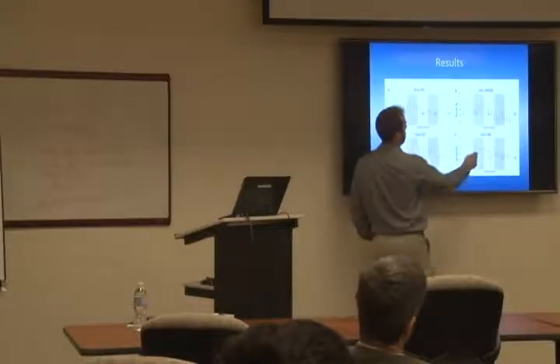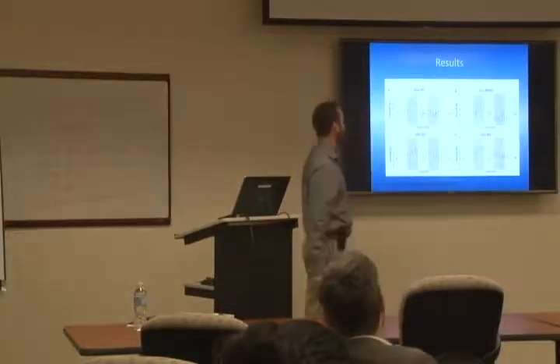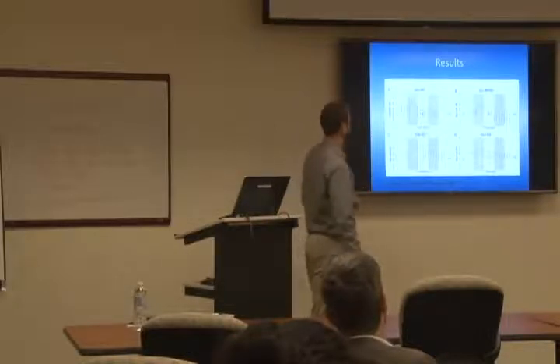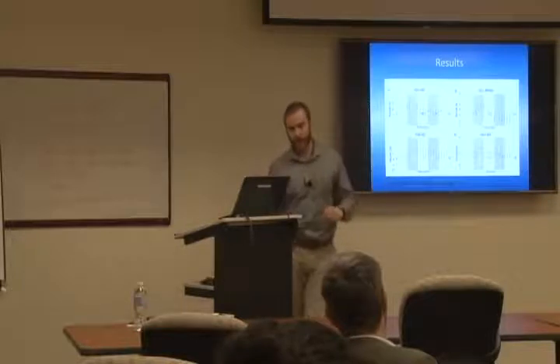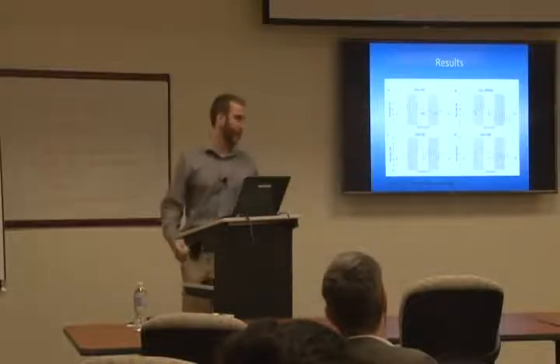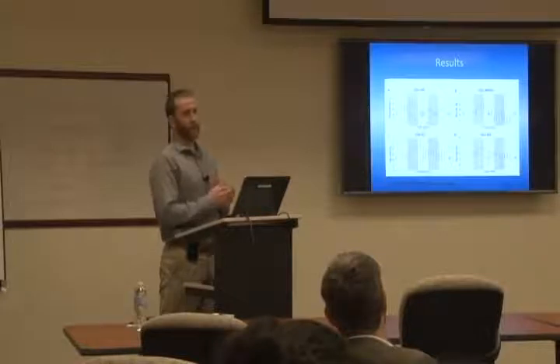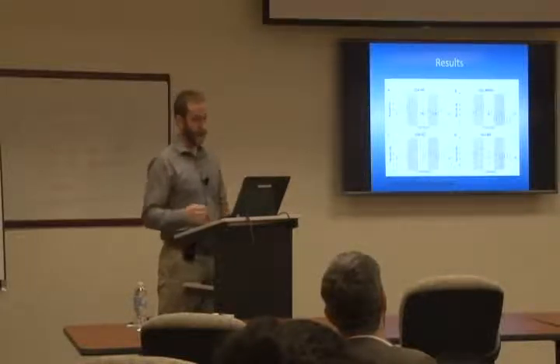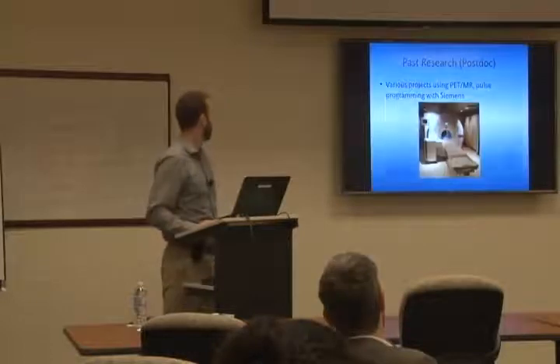One really interesting result was that there was a significant decrease in glutamate in the major depressive disorder group in the second run. Again, we don't know why. And one result that I don't have here on this graph is that there was a significant increase in glutamine in the first run of the task in the schizophrenic group only, which again is consistent with the NMDA hypofunction hypothesis. So a really interesting result, but that deserves more investigation, I think.